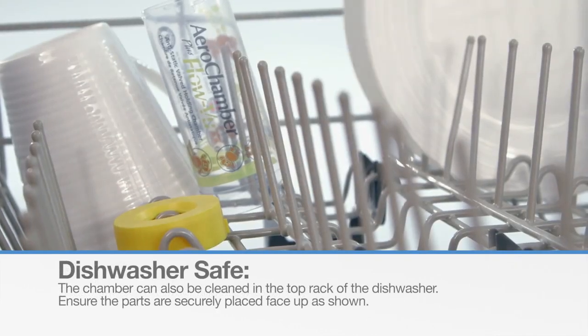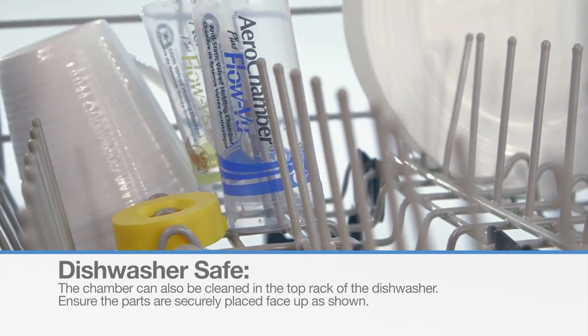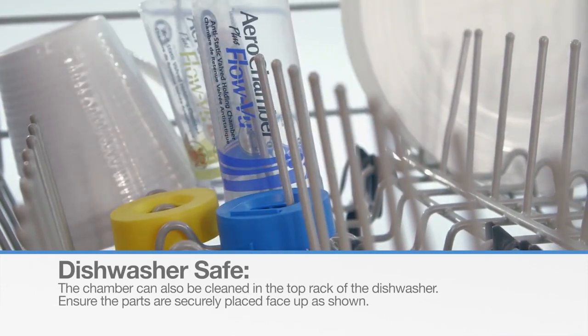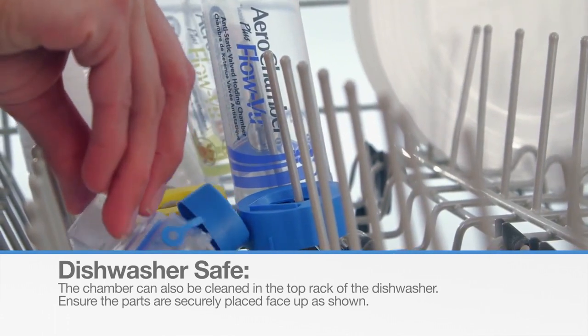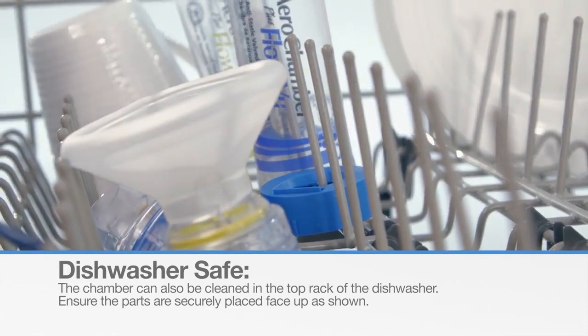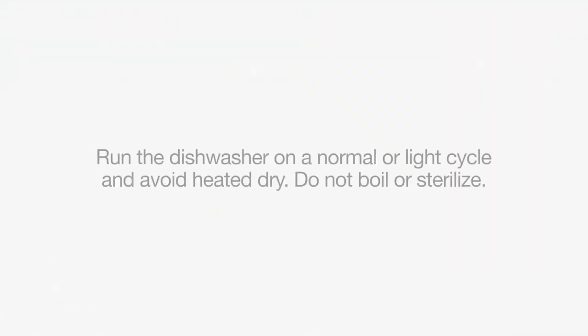The AeroChamber Plus FlowView Chamber is also dishwasher safe. If cleaning in a dishwasher, place the parts securely on the top rack. If using the face mask version, ensure it is placed facing upward as shown. Run the dishwasher on a normal or light cycle, avoiding the heated dry cycle.